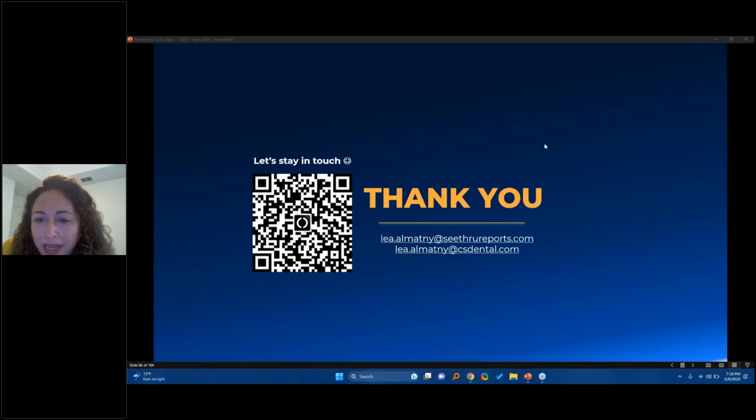Metal reduction application is available with any CBCT scan software. I'm not sure what you have, but it's available on the 9600 and the 8200 and the 8100 if you have it.